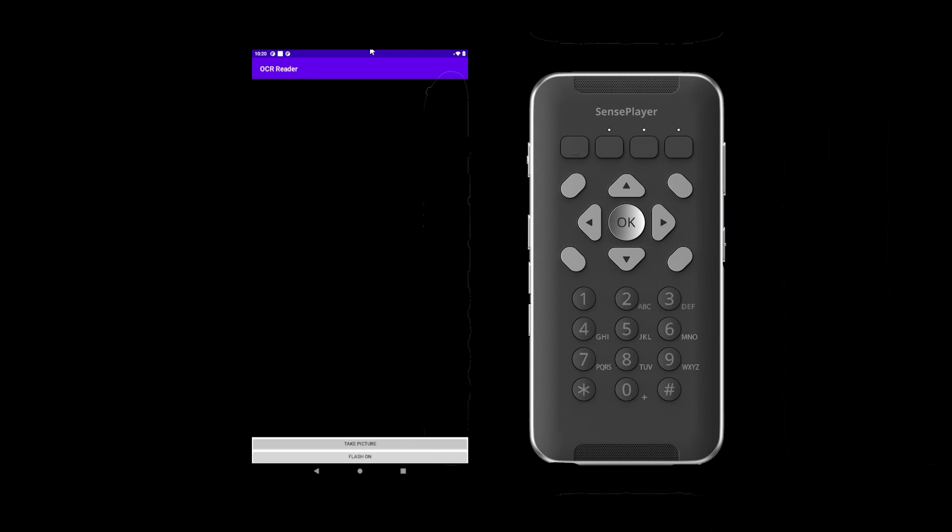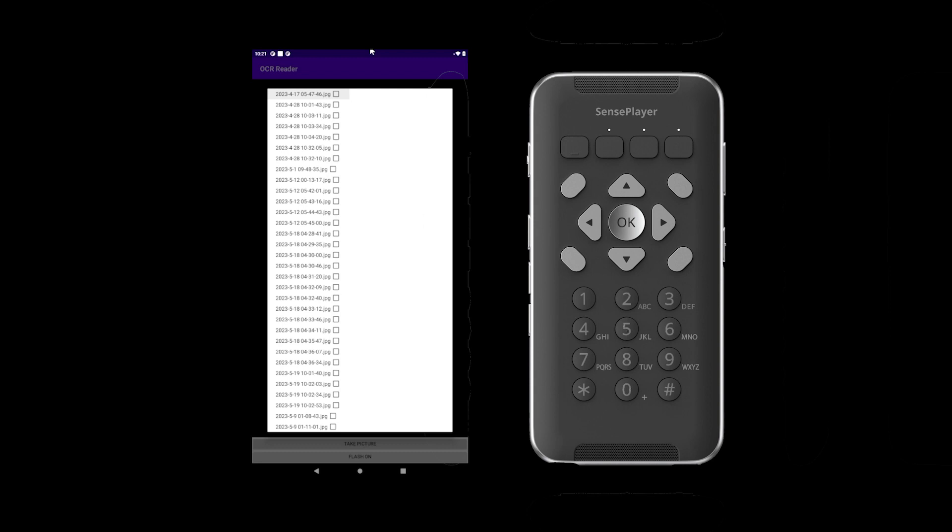You can open image files previously taken on the Sense Player and re-recognize the text. To re-recognize a previously captured image, begin on the OCR menu and open Image Files by pressing the Menu key. Scroll to Image Files by pressing the down arrow once and open this menu by pressing OK. You are placed in a list of image files listed according to the time and date they were captured. Scroll to the image you want using the up and down arrows, and re-recognize the focused file by pressing OK. To select multiple files at once, press the number 0 on the keypad, then scroll to each file using the up or down arrows.